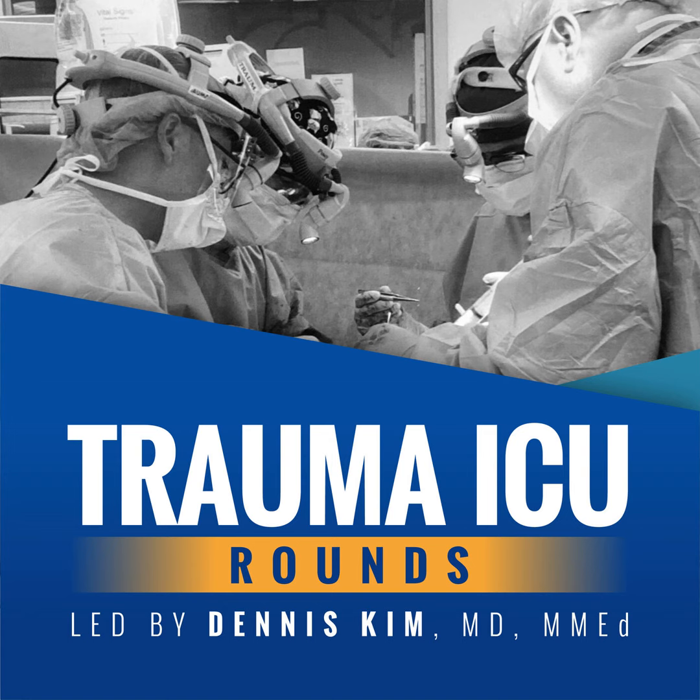Compliance is the volume change per unit of pressure. It's really just a measure of the stiffness of the respiratory system, and as we said earlier, is the inverse of elastance, or 1 over elastance. And in the absence of an esophageal balloon, it's not really possible, at least at the bedside, to distinguish differences in compliance between the lung and the contribution from the chest wall. And this is something to bear in mind, as the pressures that need to be generated to develop a specific tidal volume depend not only on lung stiffness, but also stiffness of the chest wall and abdomen.